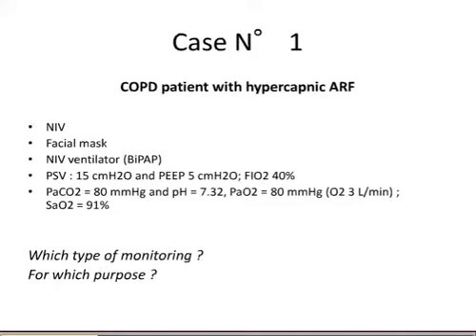I would recommend measuring the respiratory rate. This is usually the first sign to decrease when we use non-invasive ventilation. PO2 will increase if the PEEP is working. We have to examine the patient first clinically. Does he have any neurologic problem, expiratory problem, obstruction?